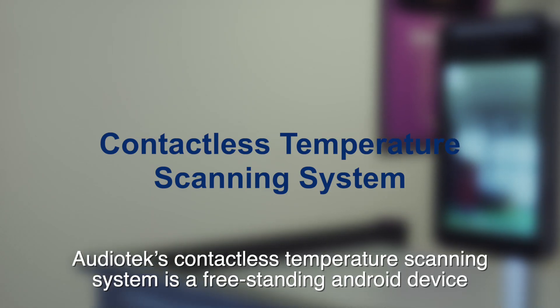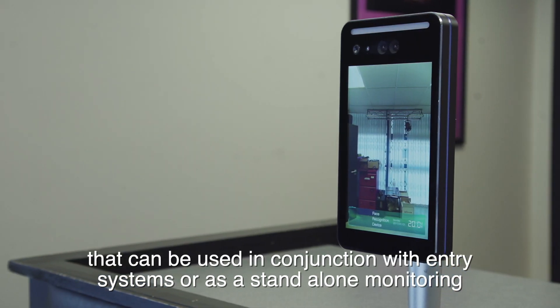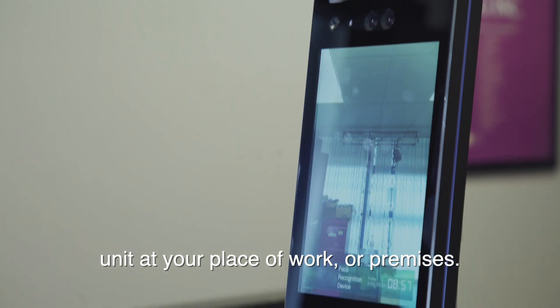Audio Tech's contactless temperature scanning system is a free-standing Android device that can be used in conjunction with entry systems or as a standalone monitoring unit at your place of work or premises.